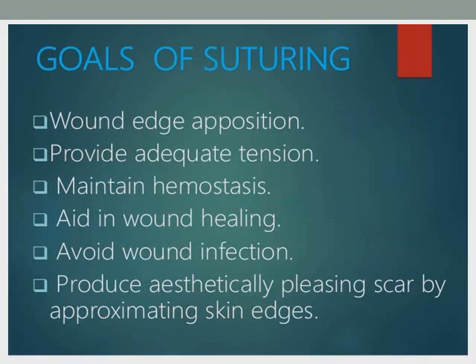Goals of suturing: wound edge opposition راح يسوي تقارب بين ال edges مالت ال wound, provide adequate tension, maintain hemostasis, aid in wound healing راح يساعد بال healing, avoid wound infection راح يمنع الانفكشن, produce aesthetically pleasing scar by approximating skin edge.